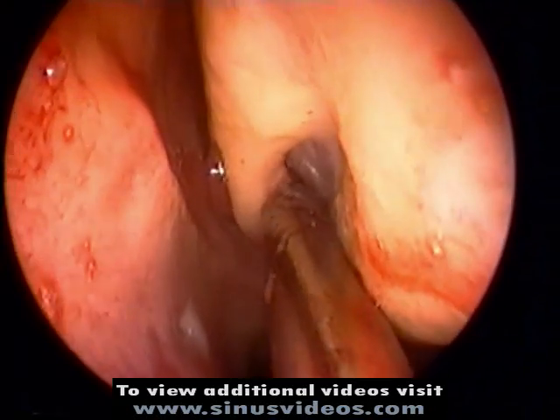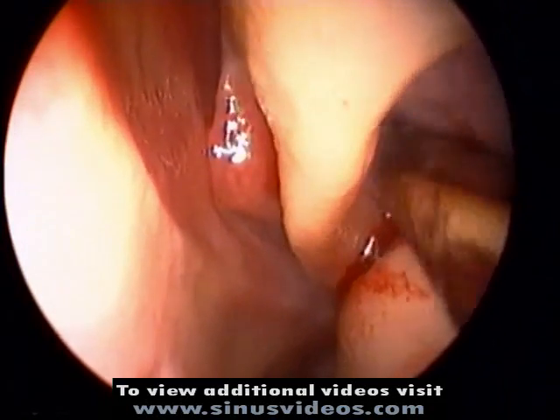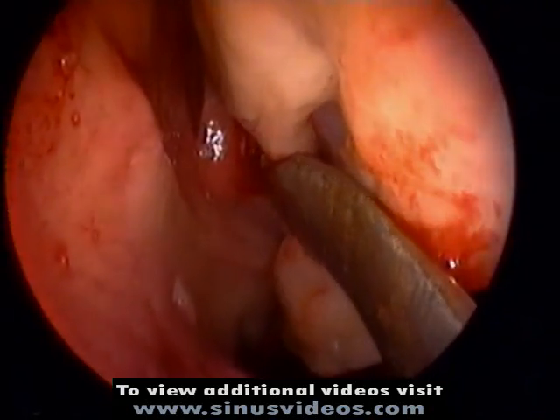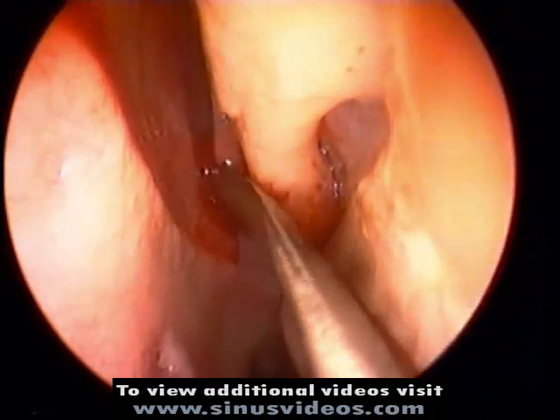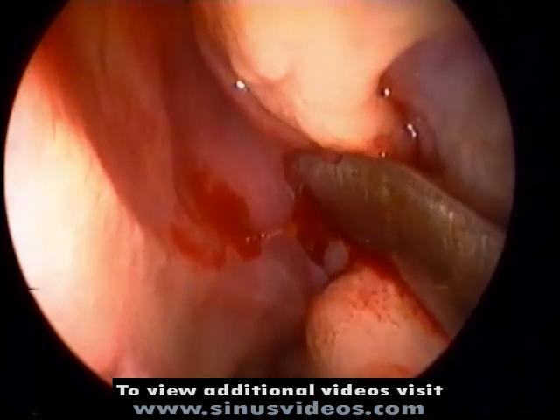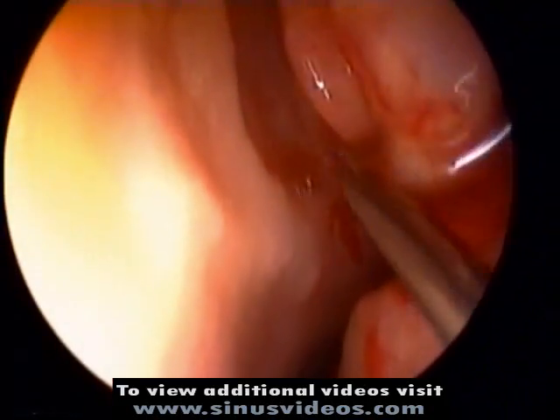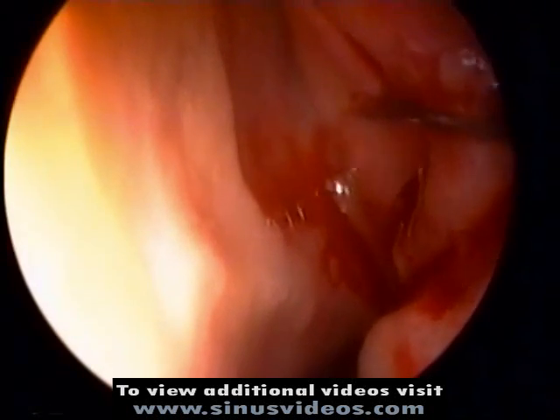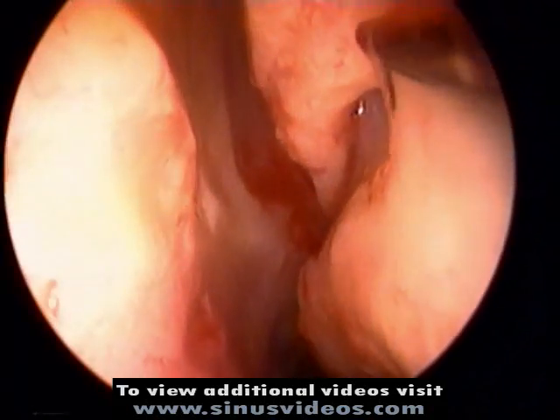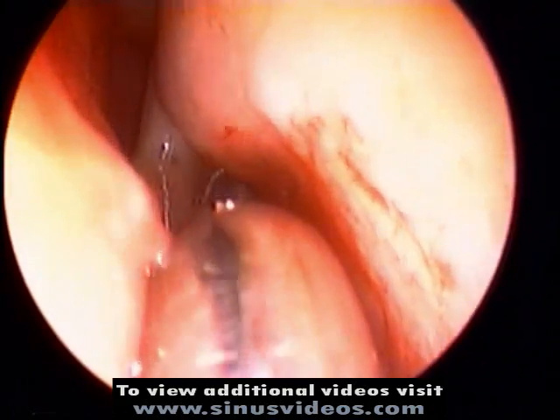The region of the sphenoid sinus can be identified by reflecting the middle turbinate laterally to expose the superior and supreme turbinates. Between the turbinates and the nasal septum is the sphenoethmoid recess, where the natural ostium of the sphenoid sinus will be found. In anticipation of enlarging this ostium, injections are placed in the superior turbinate as well as the posterior aspect of the nasal septum, which infiltrate in a posterior direction.